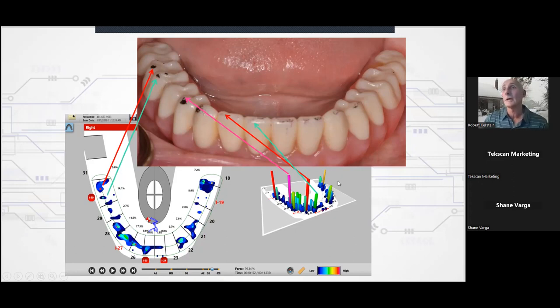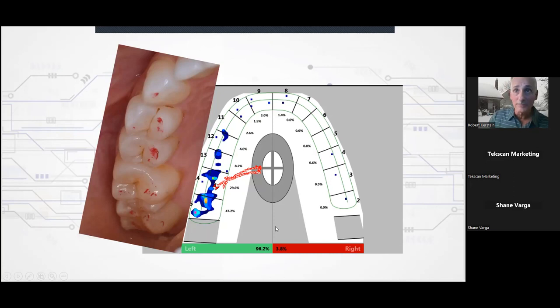Now going a little to the right side, you see the canine is moderate force, and then there's a really small mark out to the distal buccal. That's pretty moderate force. That's what you actually have to do case after case in order to be successful. The last one I'll show you is one of an excursion. So here the person is moving to the left, and they're in the middle of the excursion. And so this is a little bit more challenging to cleanly read.